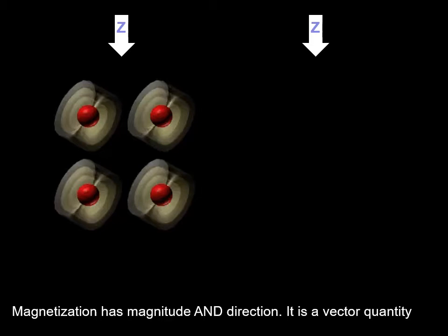We will now progress from a single nucleus to a group of nuclei. In this animation, 4 nuclei are shown, but it could be any number of nuclei because the concepts are the same for hundreds or even billions of nuclei. The direction of the applied field is shown by the white arrows at the top of the screen. This is conventionally called the Z or Z direction.